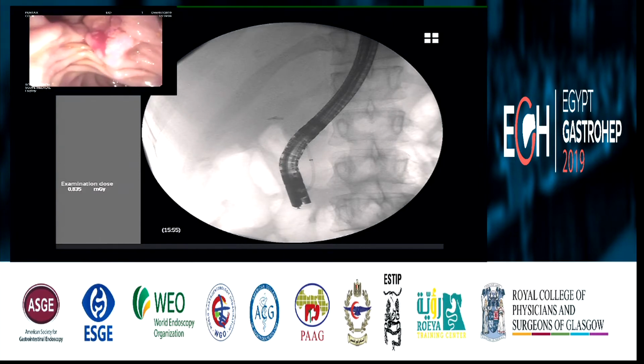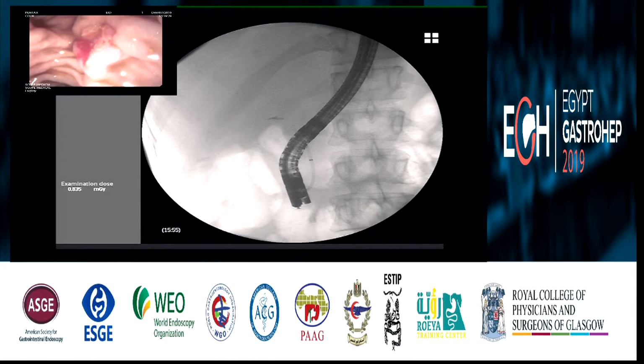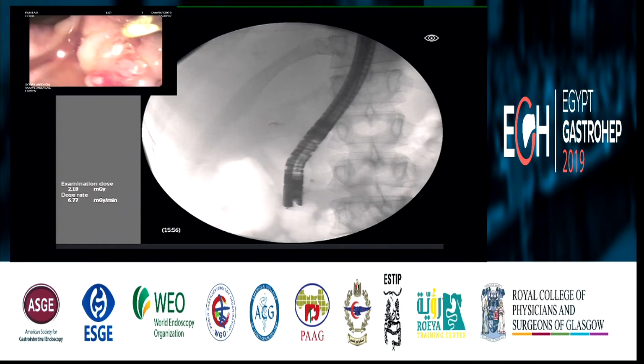So, Ivo, do you try to get the wire before you put any contrast in, or in benign stricture this is not as critical as in malignant stricture? It's not so critical, but since it was very tough to pass the stricture, I just tried to pass it with the catheter, and that doesn't go. So I prefer to go deeply with the wire inside the liver and then to inject from the liver, and to see how is the situation. So you make sure you can drain. Yes, where you have injected, because the wire is already there. And another thing very important is that since the stent is a foreign body, there's always some debris inside. So if we inject from down, we will push some debris inside the liver.